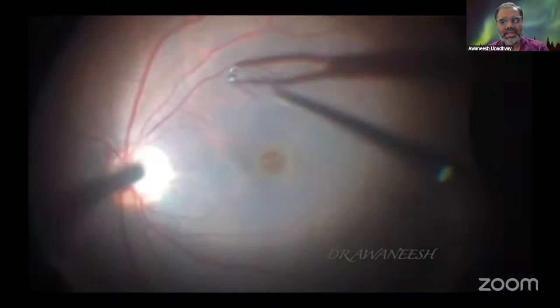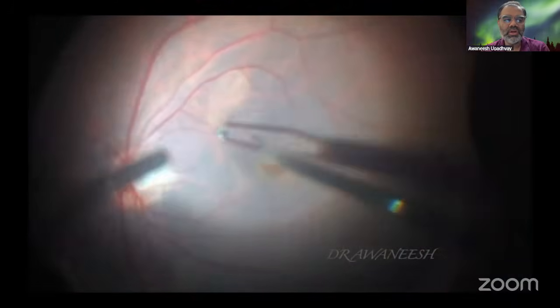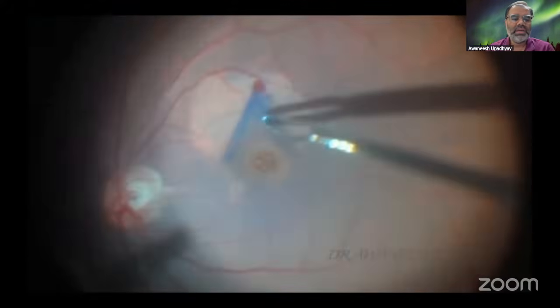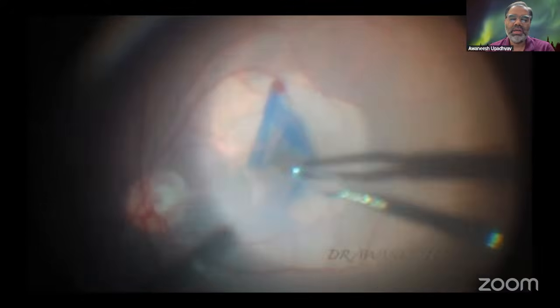Yes, thank you. So basically, now we have had inverted flaps, which have been discussed. So I'm just taking it a bit up with stabilizing these flaps. Sometimes the flaps can get dislodged, and sometimes, what Dr. Divyansh was talking about, epiretinal membranes. So here we stain the posterior pole with BBG dye, and then we start with the peeling.